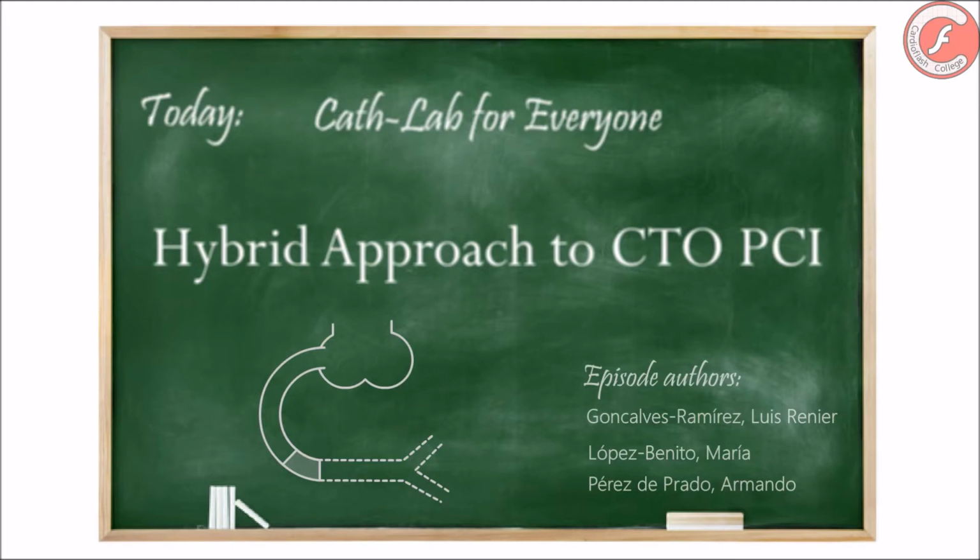Today, we count with the collaboration of Dr. Maria Lopez Benito and Dr. Armando Perez de Prado, interventional cardiologists of the Hospital de León. Together, we will review everything you need to know about the hybrid approach of the coronary chronic total occlusions. Join us!